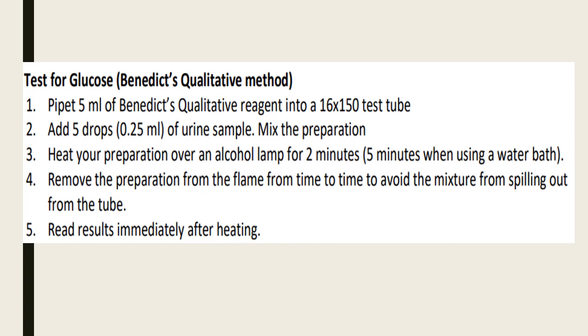Okay, and so you already have the grading as such. Of course, if it is just blue, then that is negative, and so your urine does not contain glucose accordingly.